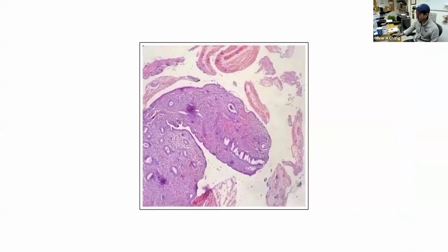Okay, that's it. From normal skin, I think I went over all the structures that you'll see. But remember, you don't really think of these structures individually. You see skin as a whole. Think about the function. Think about what things are supposed to be doing and how good of a job they are at doing it. And I think that's going to be a good foundation, a good start to how to approach skin specimens.